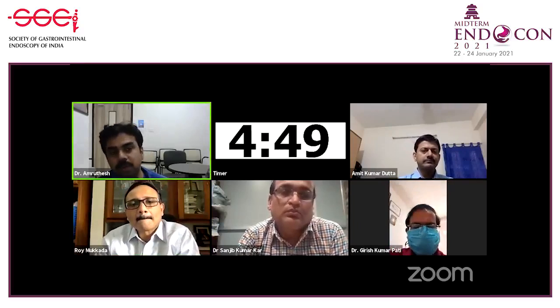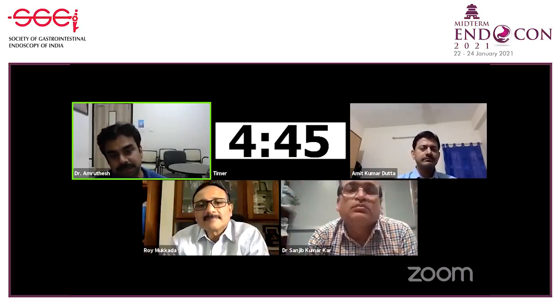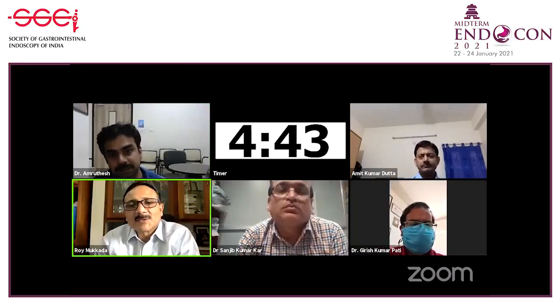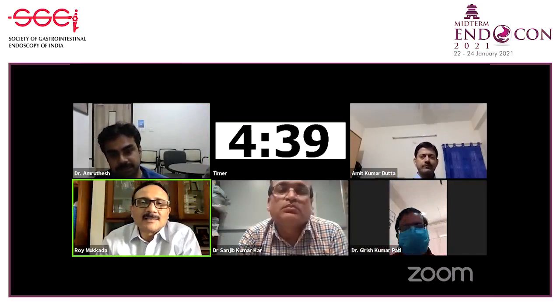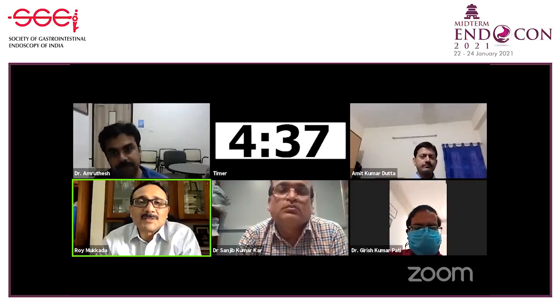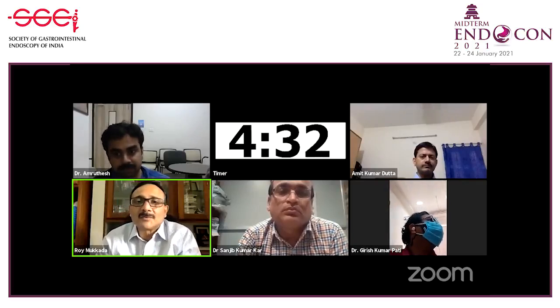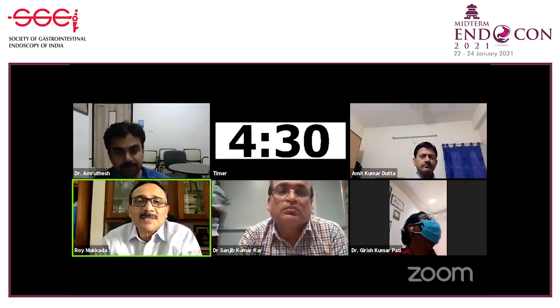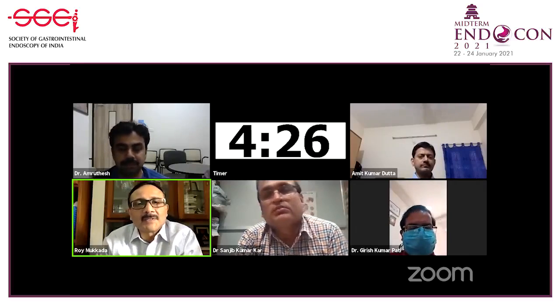And how frequently do you follow up the cases after the ESD, and if there's recurrence up there, how will you manage those recurrences? Yeah, that is a good question. This is especially so with EMR. If you think that you've done a piecemeal resection, then you need to have a very close follow-up, 6 monthly at least for some time. The follow-up should be there.